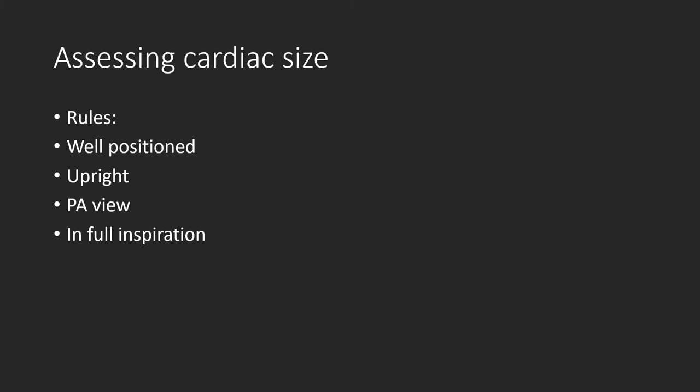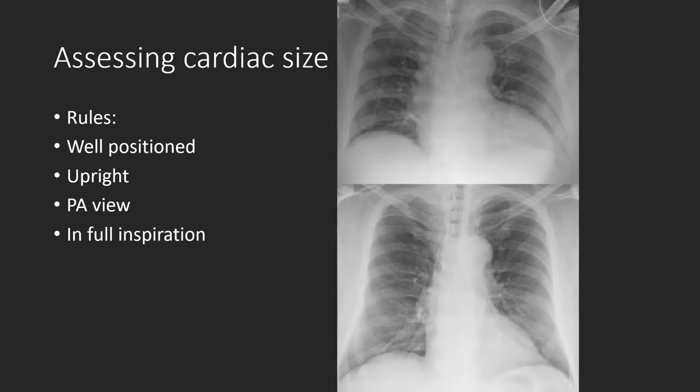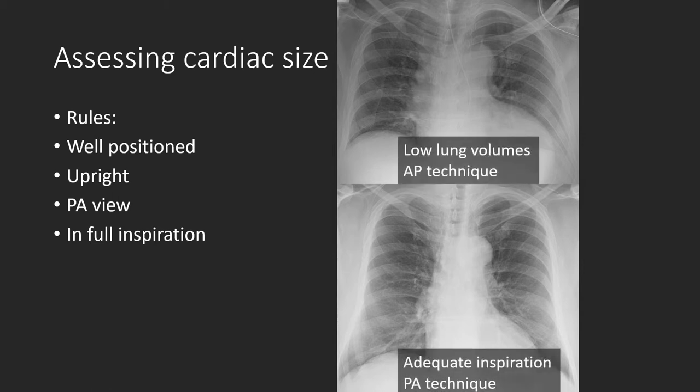This measurement comes with some rules. First, the patient has to be well positioned and not rotated. Second, they have to be upright. Third, it should be obtained as a PA view — posterior to anterior. And lastly, the chest x-ray needs to be acquired during full inspiration. Any of these rules, if not met, could result in pseudo-cardiac silhouette enlargement. Here's an example of a patient with chest x-rays obtained within hours of each other — one with low lung volumes and AP technique, the other with adequate inspiration and PA technique. Look how much the heart changes in size. It's important not to overdiagnose cardiomegaly, particularly on inpatient portable exams, which are almost never upright, PA, or in full inspiration.